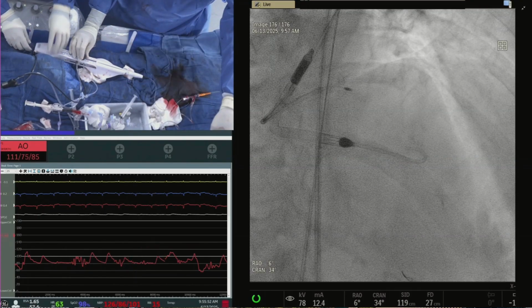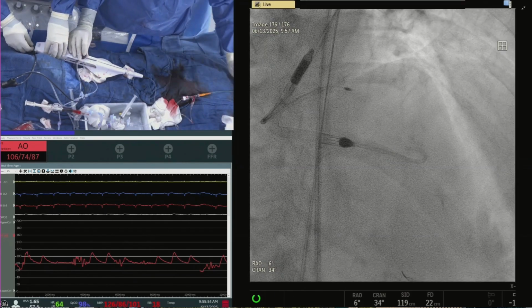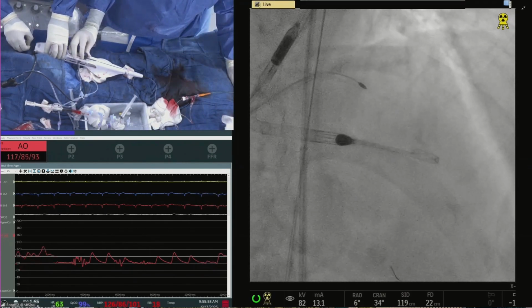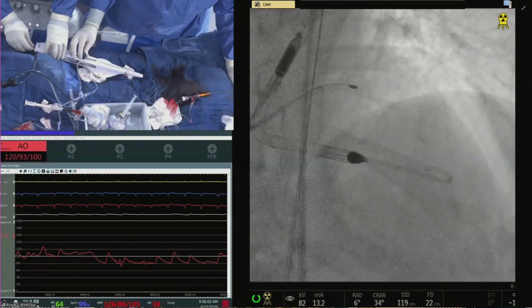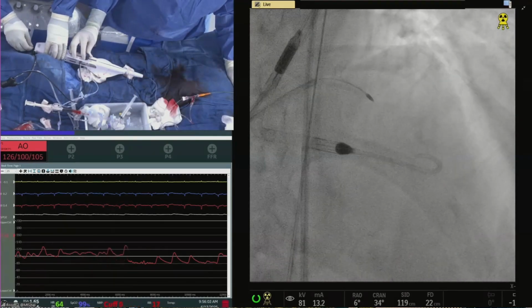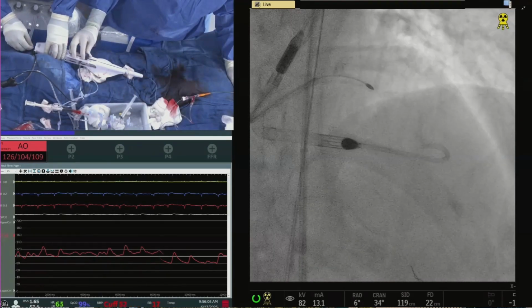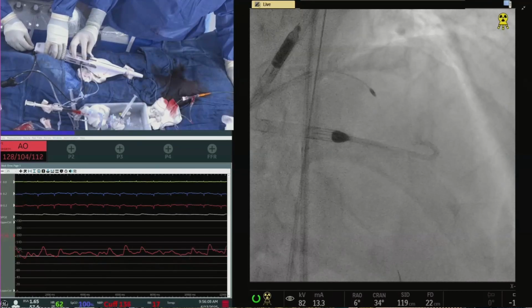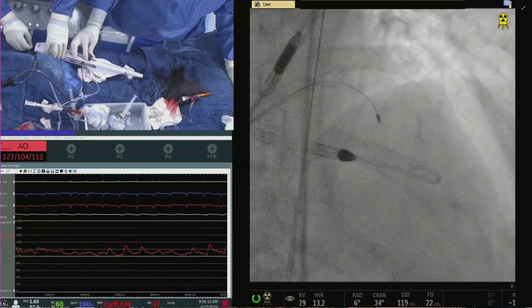No, go magnify. This is low mag. Yeah, good. Okay. So is it the same burr size, or did you go up higher? No, we went higher, 1.5. Remember earlier, Greg was also discussing why don't we go to a higher burr size in the LAD? So this is where we are, where nothing was making a turn.